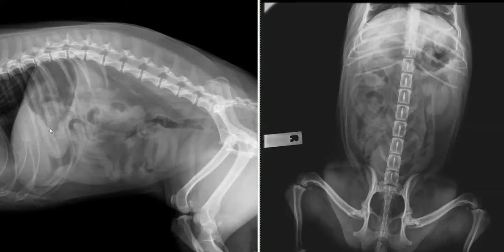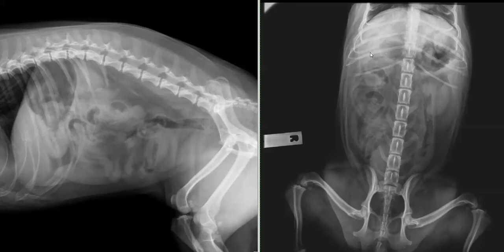So that's most of the organs interpreted. Now we're going to evaluate the gastrointestinal tract — I leave that to last because it's definitely the hardest. The stomach is usually contained within the costal arch and will variably contain gas or ingesta. Ideally patients should be fasted before abdominal radiography, but sometimes in emergency situations this isn't the case. The gastric axis is more about hepatic size than stomach size. You can see rugal folds in the fundus of the stomach outlined here. The stomach turns into the duodenum, which runs down the right lateral body wall and sometimes shows up with gas in it, although we can't see it in this patient.